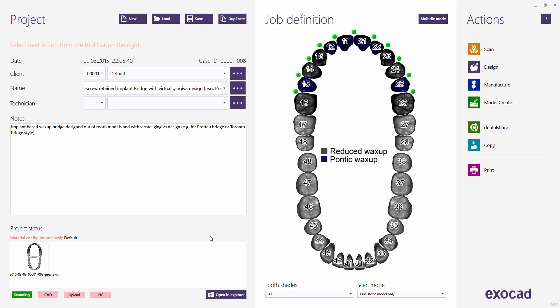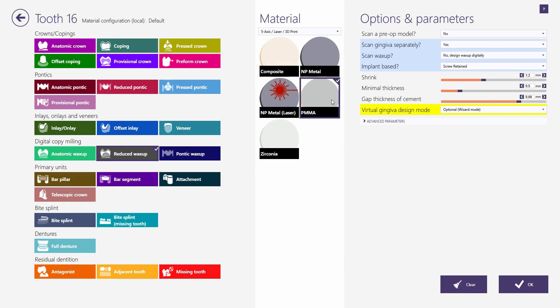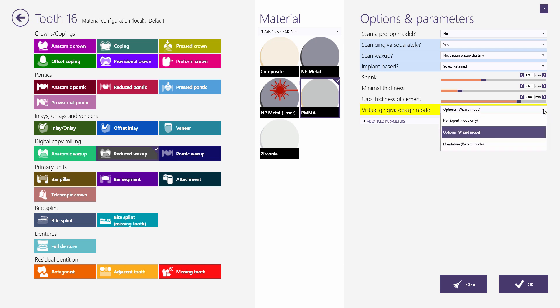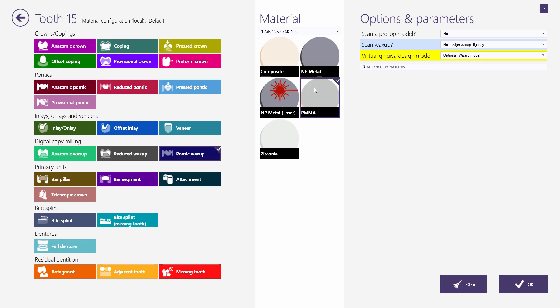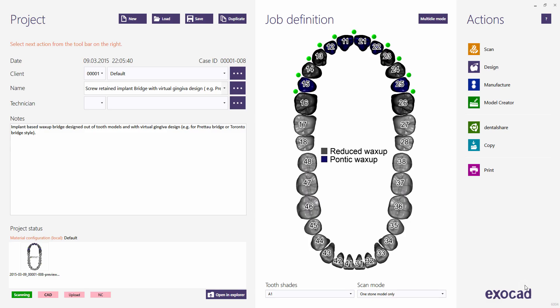Starting with Exocad version 2016, there are new options for Wax-Up restoration types called Design Wax-Up Digitally. Furthermore, for all restoration types there is now a Virtual Gingiva Design Mode. The same modes are also available for Pontix. You will find more detailed information about Virtual Wax-Up and Gingiva Design in a separate video tutorial.